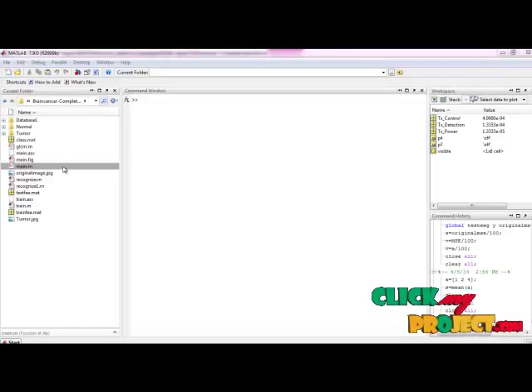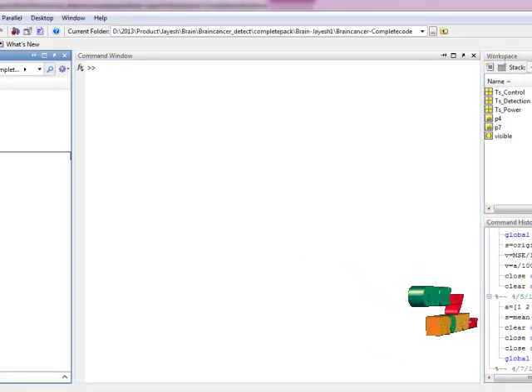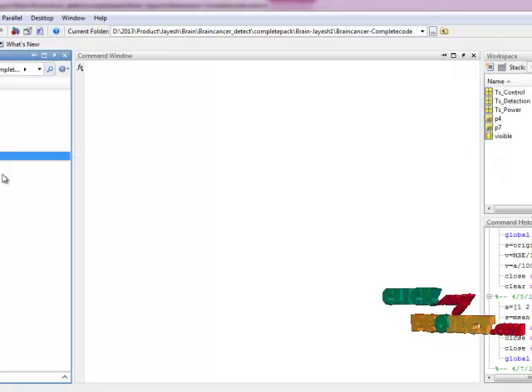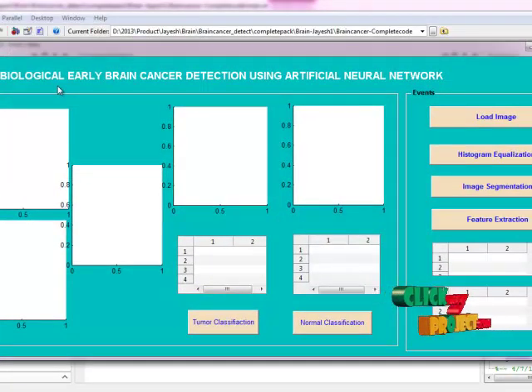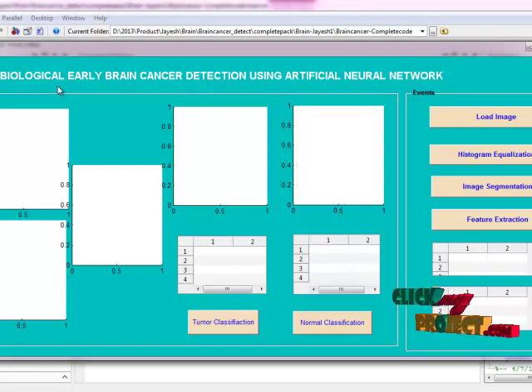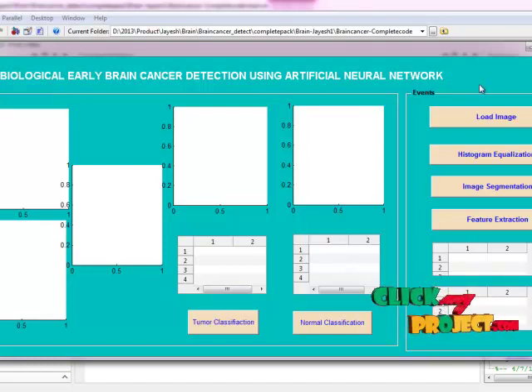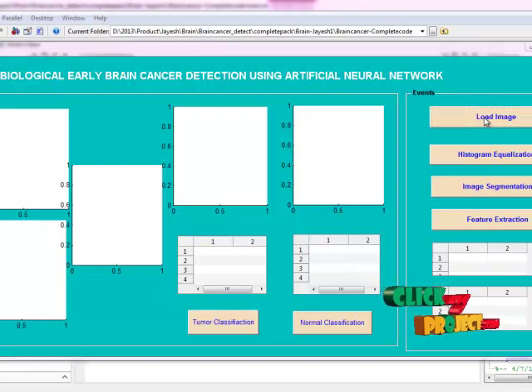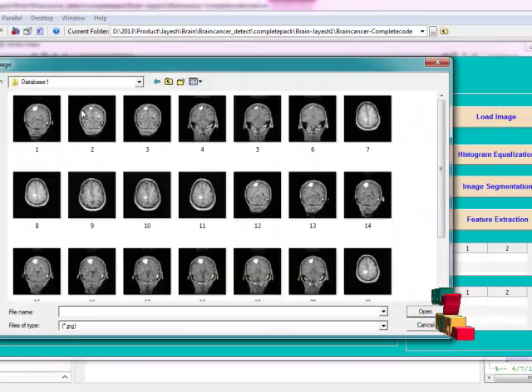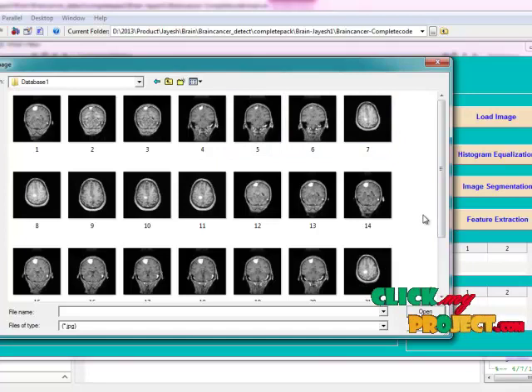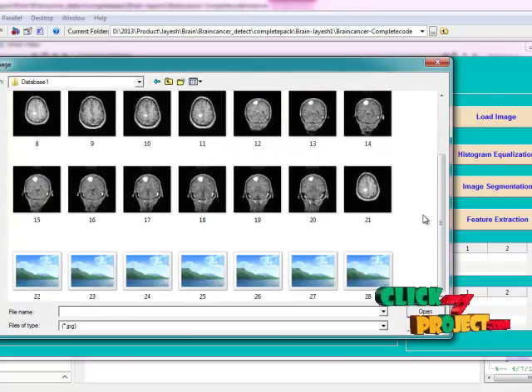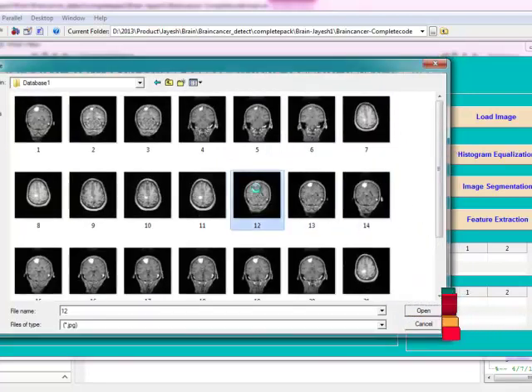Now let us see the execution of the program. First we select the main file and click run. This is a MATLAB Guide window designed for biological early brain cancer detection using artificial neural network. Then we load our input image from our database. We can select any one of these — now I select this image.